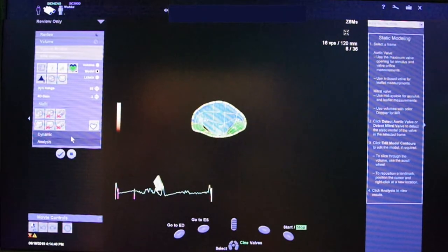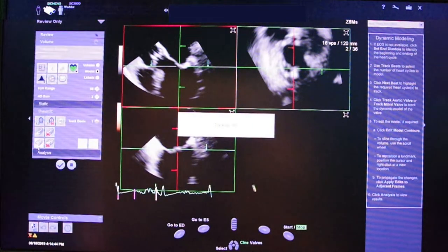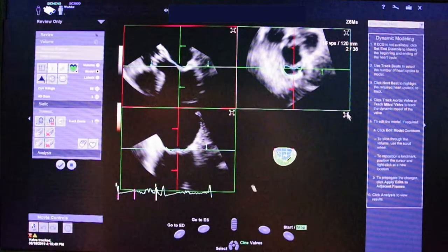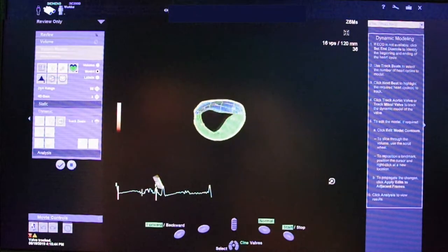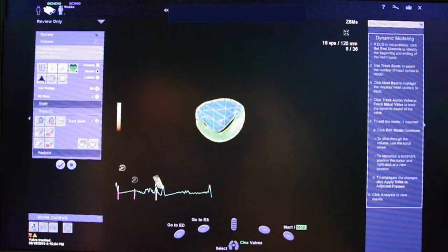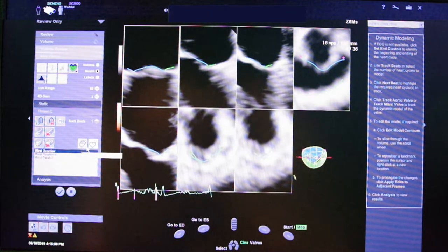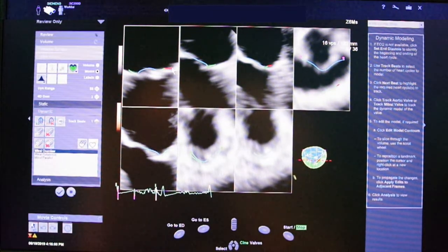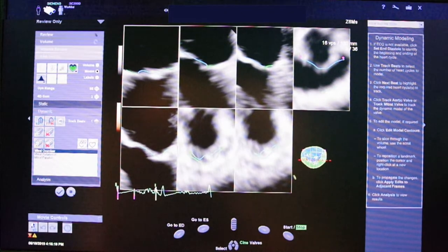EasyValve also has a dynamic segmentation tool that automatically plays a 3D model of the valve in each frame of the cardiac cycle. This way, a dynamic assessment of the valve is possible. A tool for the manual editing of the model is again available, and the revision will be applied to all the frames by clicking on this button.